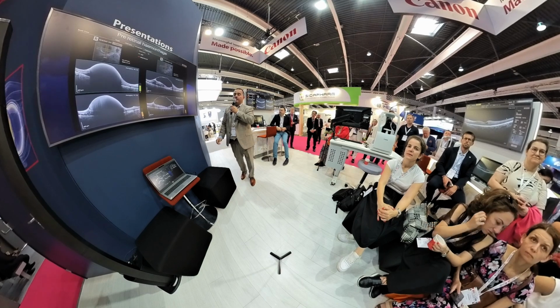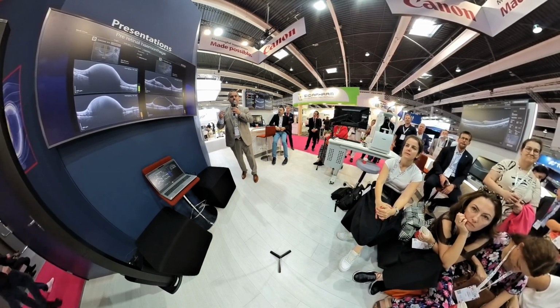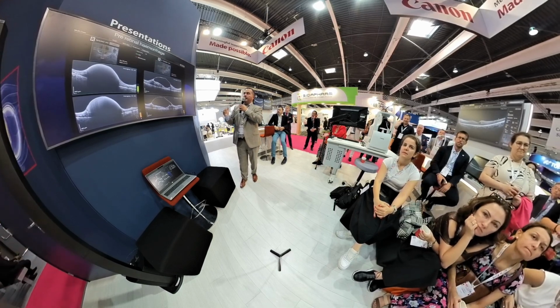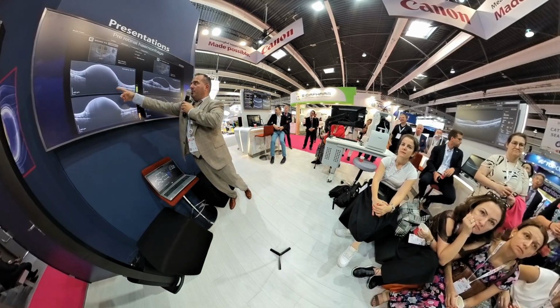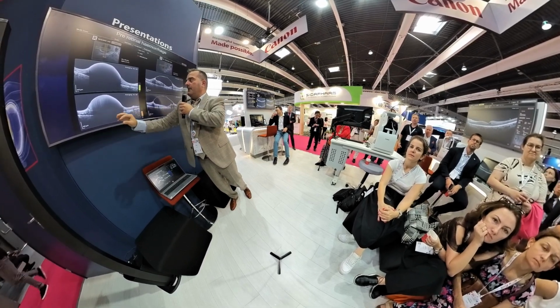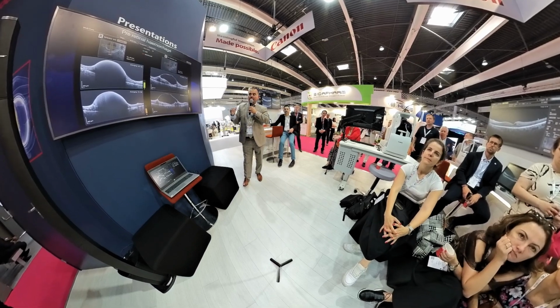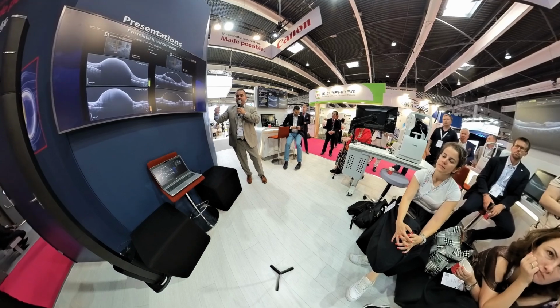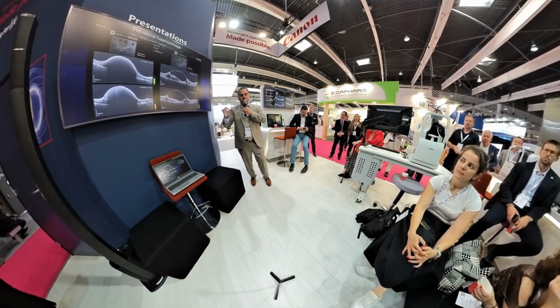This is an example of preretinal hemorrhage. The patient had a retinal macroaneurysm. And what I want to show is the penetration, and through the blood we still might see some details of the retinal morphology, which means that the algorithm which determines if this is a useful image or not is quite robust.